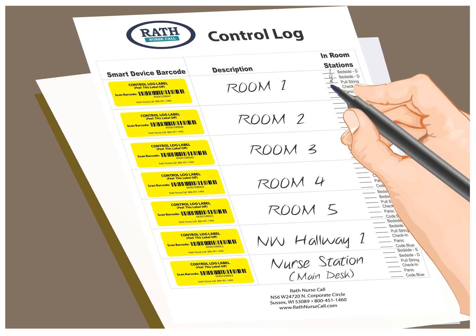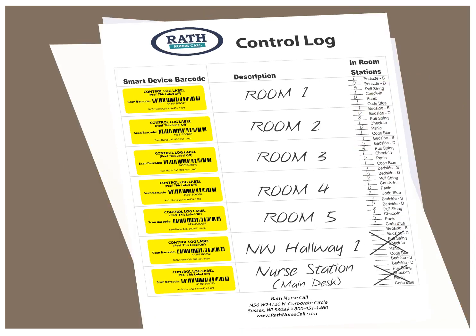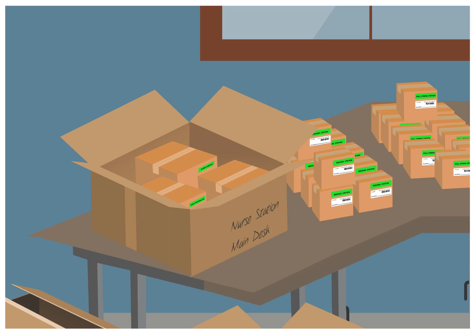Mark the control log with the switch stations associated with each smart device. This keeps a running inventory checklist during installation. Finally, separate and label your nurse consoles and host controller.